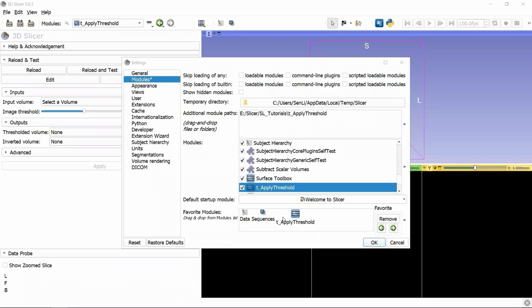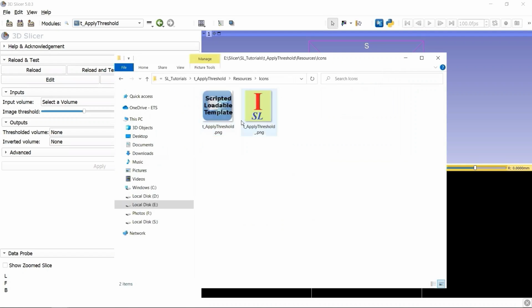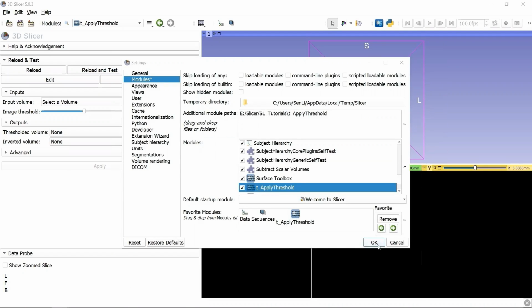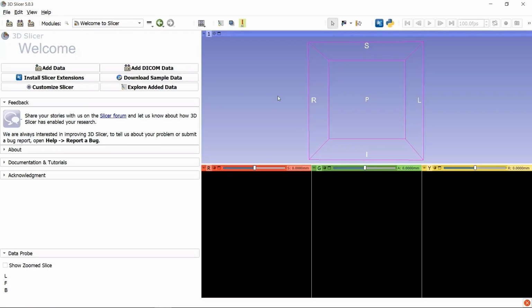However, this icon here is a general icon that may not be distinctive. We want to change this icon image. Let's go to the module folder, Resources, and Icons. We remove all the existing icon images, and change the name of the icon we want to replace. Now let's go back to the 3D Slicer, click OK, and restart. Here we go. Now we are able to go to our module through the toolbar favorite modules.